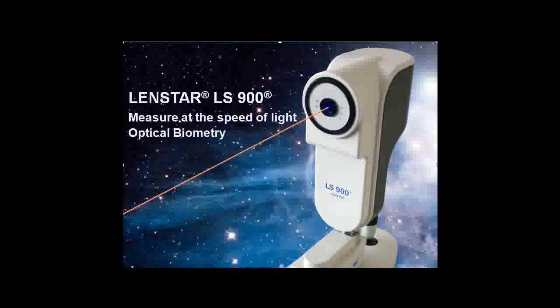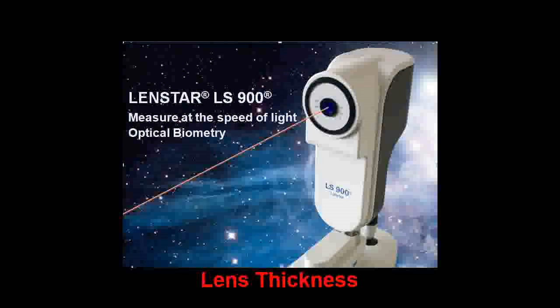Welcome to iSuite Biometry. This segment will illustrate the lens thickness measurements acquired using the LENSTAR. Lens thickness measurements are captured along the patient's visual axis, thus producing a highly accurate and reproducible measurement.